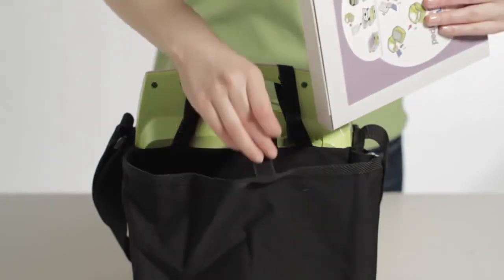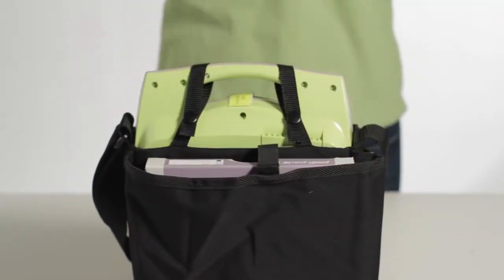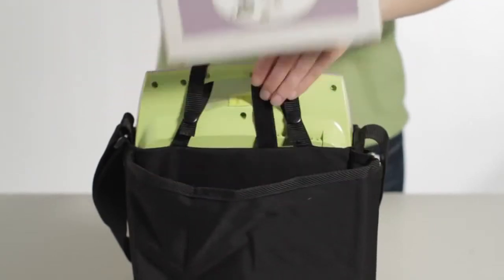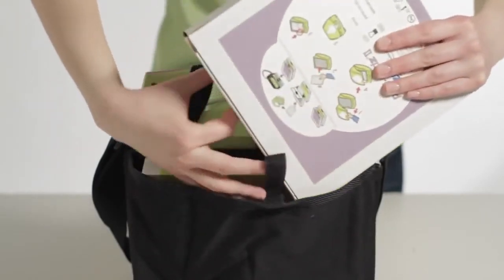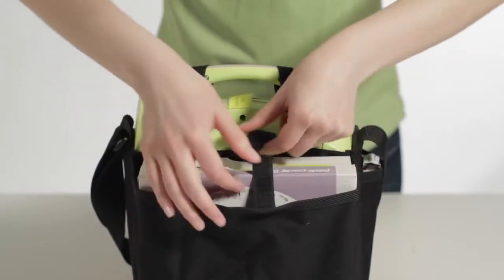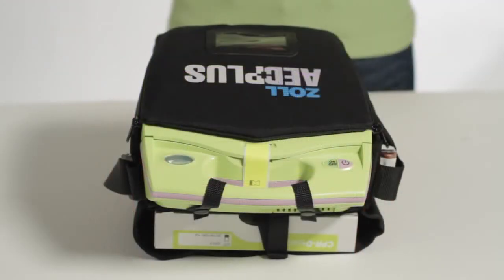If you purchased a pediatric pad with your AED Plus, you can keep it in the same pocket that holds the backup adult pad. If you have both a backup CPRD pad and a pediatric pad, you can keep both in the same pocket. First, put the CPRD pad into the pocket. Then put in the pediatric pad. Make sure you keep the boxes oriented so the expiration dates are exposed. Together, these two boxes will provide your AED Plus with a more than adequate support platform in a rescue.